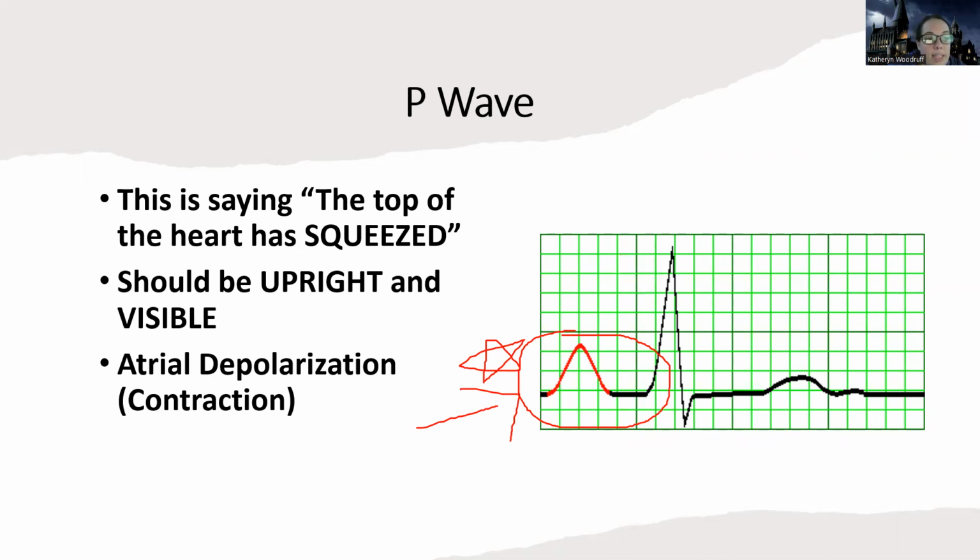This thing is the pointy thing. Oh my God, I'm going to back up. All right, this, the P wave. All right, sorry, I was thinking about the pointy thing. So this is a P wave. So this is what you're going to look for.